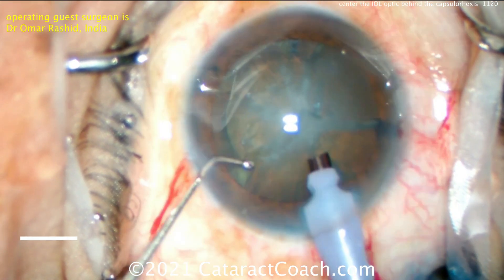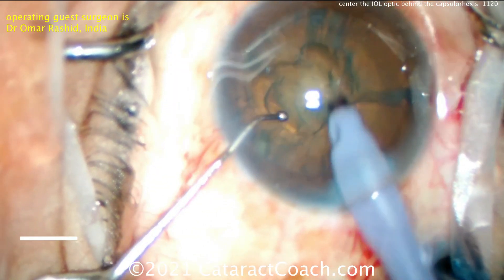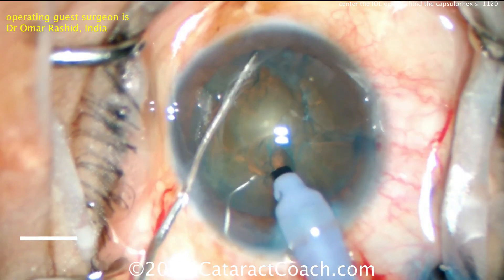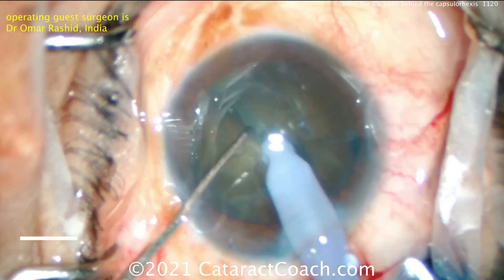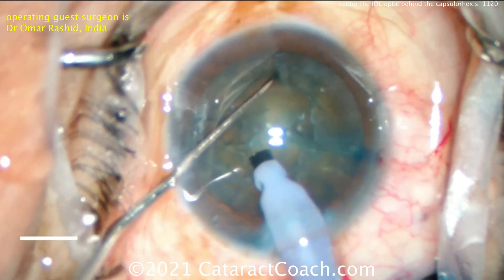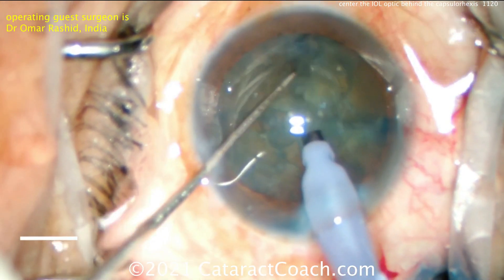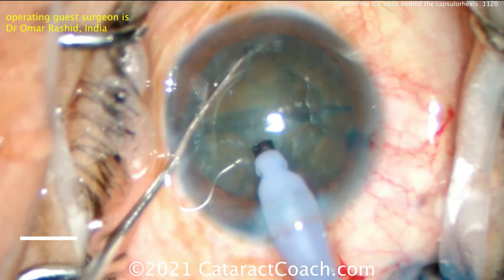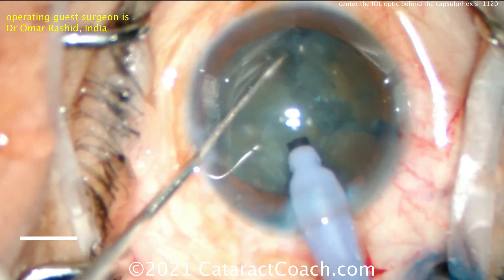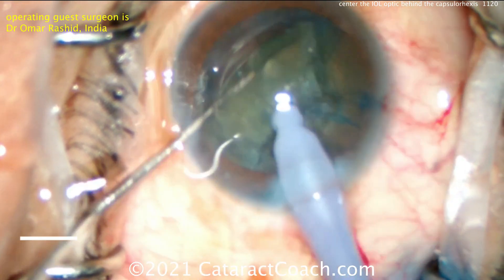Let's see the surgical technique for nucleus removal. Cleaning up some of the anterior cortex. There's a chopper with a ball tip, and then a horizontal chop — very nice. Making that little pit at the beginning is actually helpful because you can really get good traction on the nucleus. This is a very nice horizontal chop technique and the nucleus is now going to be split into four pieces. Notice how that chopper goes under the capsulorhexis and around the lens equator. Now each quarter can be brought up and sub-chopped even.